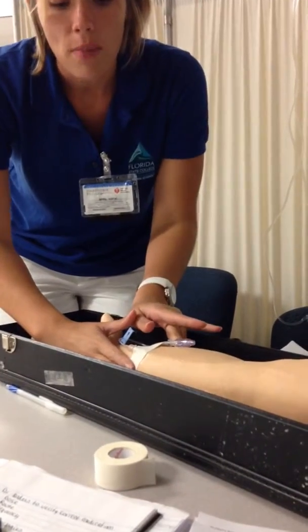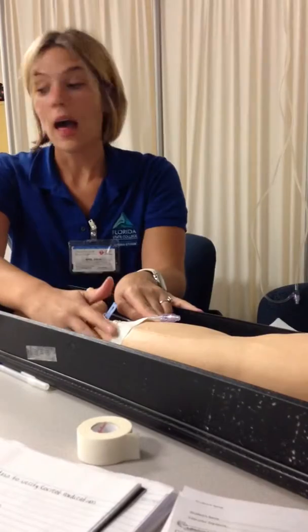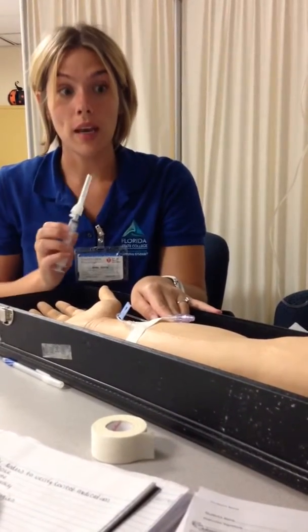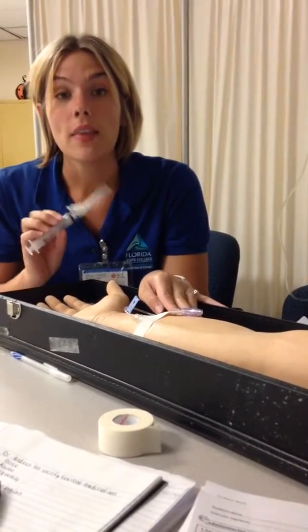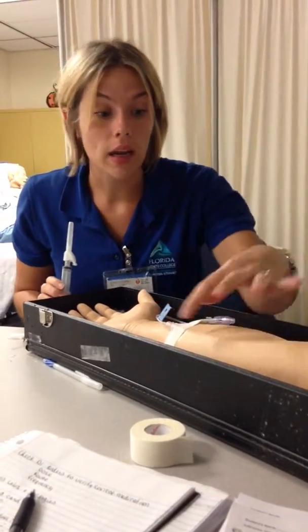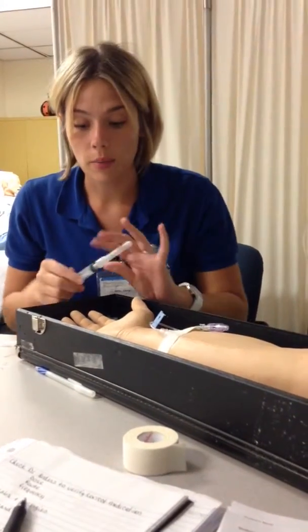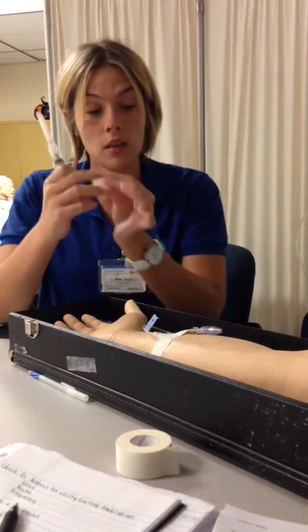I check the patency of my client's IV: push, stop, push, stop, push. I have already drawn up 6 mLs of normal saline that I'm going to flush. I'm going to flush 3 mLs of saline to make sure the patency of this is correct. I do not have to do heparin because you only do that with a PICC line or central line. I've assessed there's no pain, swelling, and the patient hasn't had any complaints. Then I will take my alcohol.